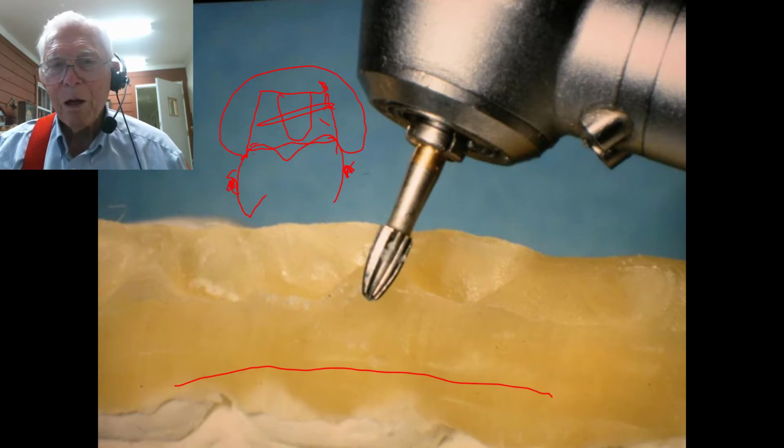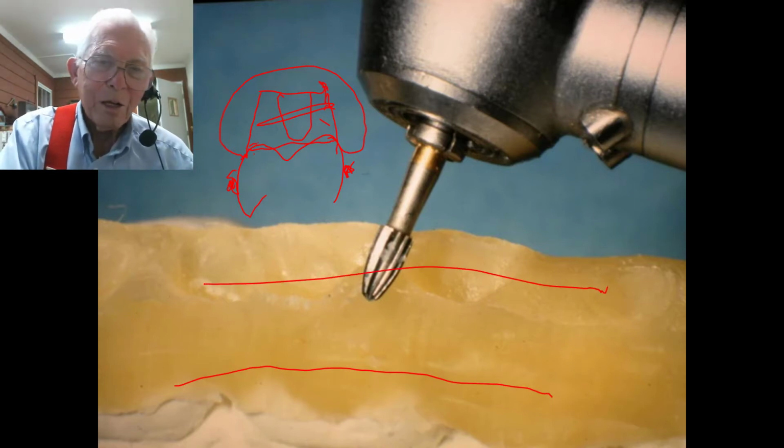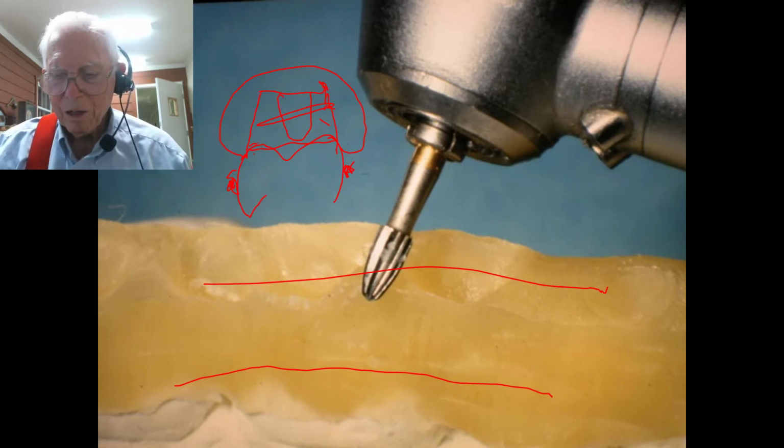So bonding blocks is a neat thing, and if you just bond them on one side of the mouth, I will tell you in just a couple of months these teeth are touching over on the other side of the mouth. I think we've shown you some cases like that.